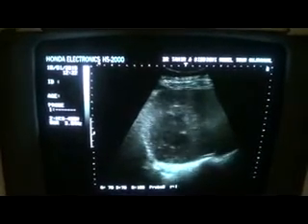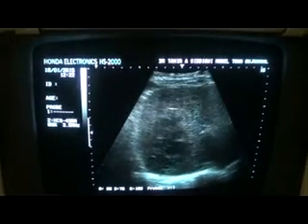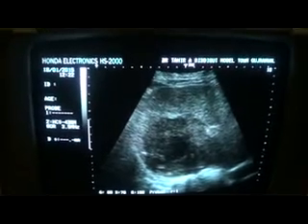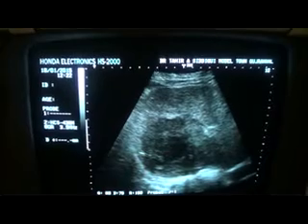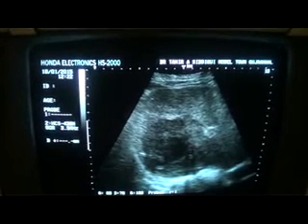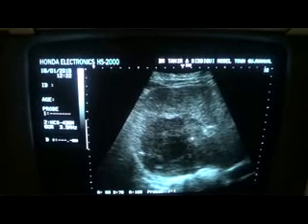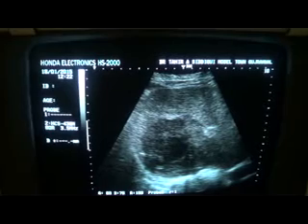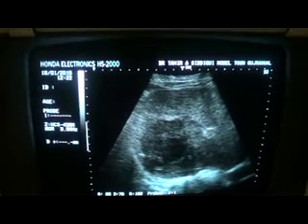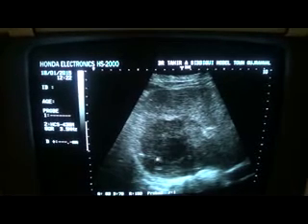Now, let's study this area in a bit more detail. See, the strong posterior back wall is not seen, maybe due to two factors. One, there is a right hemidiaphragm here, but even then, had this been a totally cystic area filled with echoes, we would have seen a strong back wall or increased acoustic enhancement. Now, as we are seeing a clear black posterior wall with no acoustic enhancement, it does not mean that this is a solid mass.